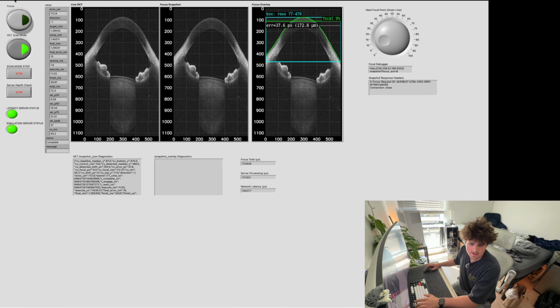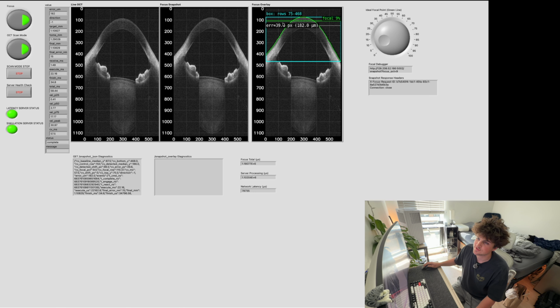So let's go ahead and see the system in action. Here is our live OCT feed. This is just a simulation coming over our network, but treat it as the real deal. I want to focus. My patient is under my scanner right now. So here's what I'm about to do. Status is good, everything looks okay. Let me click on focus and now take a look. 182 micrometers. This was sent over to the stage. As we can see right here, the stage completed the command in 58 milliseconds.